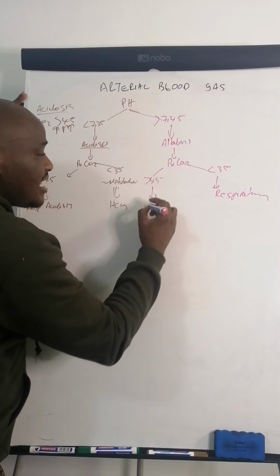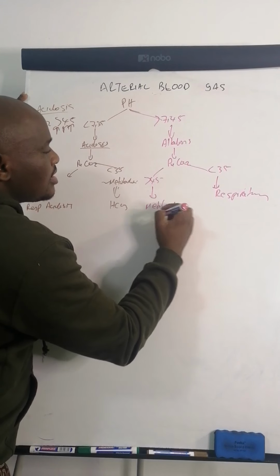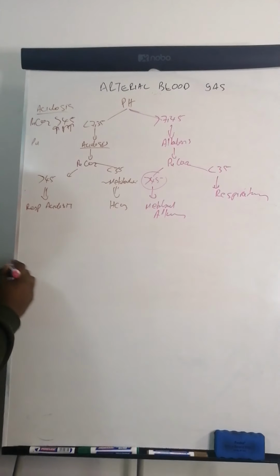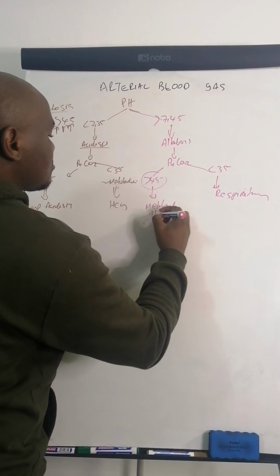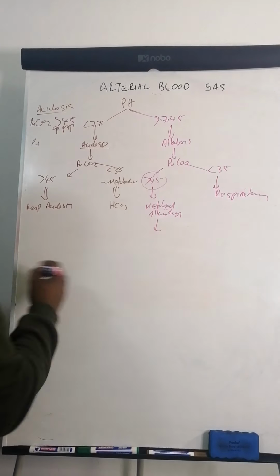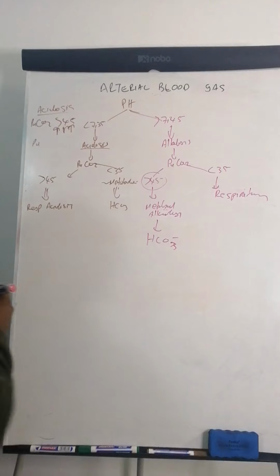So this is most likely a metabolic alkalosis, and this is just compensation. I hope you get that. So what you can do, you can go and check your bicarbs. What is your bicarb doing?